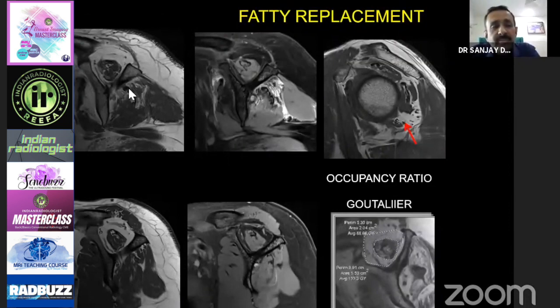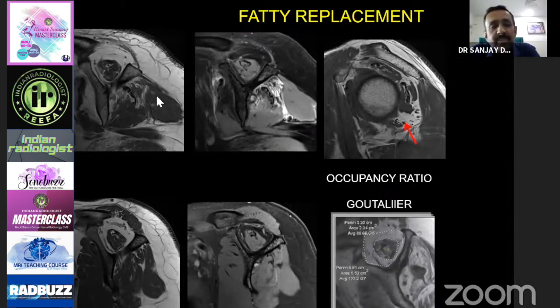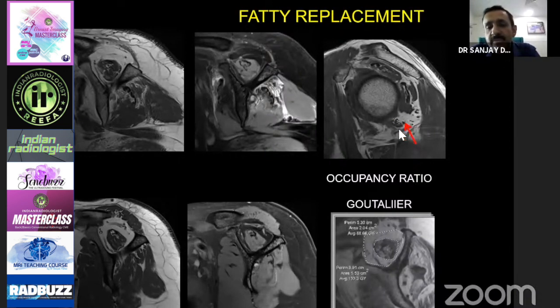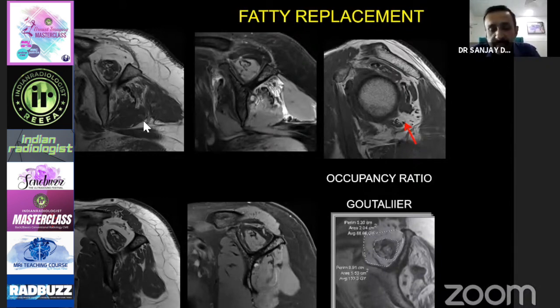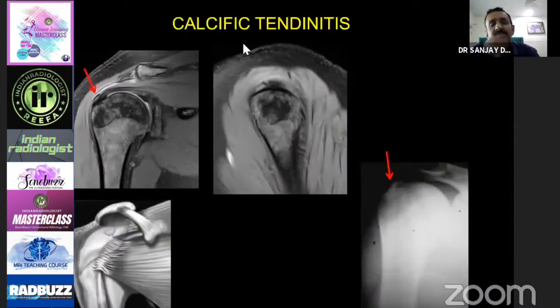Fatty replacement is the replacement of the supraspinous fossa or any muscle belly by bright signal on T1-weighted images. It is graded as: less than 25% is grade 1, 25 to 50% is grade 2, 50 to 75% is grade 3, and more than 75% is grade 4. Here you see the teres minor muscle is completely replaced — that is grade 4 fatty replacement. This is around grade 1 fatty replacement of supraspinatus, and this is grade 2 fatty replacement of infraspinatus.